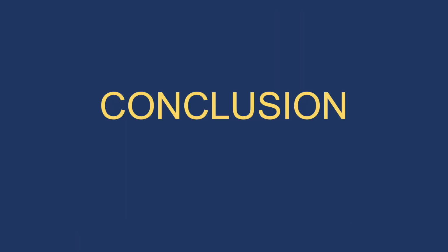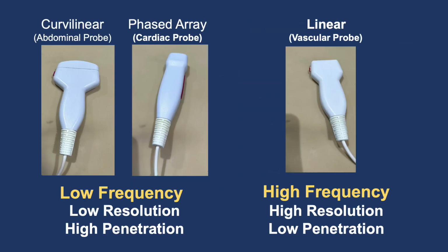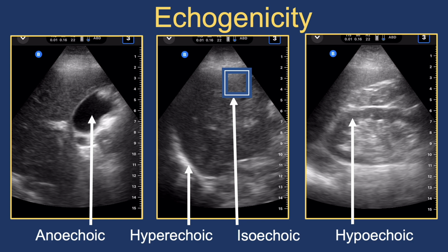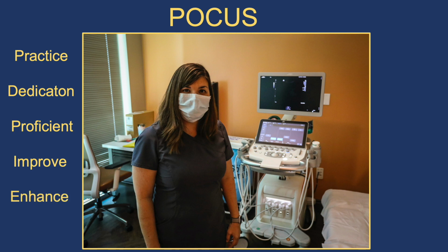In conclusion, understanding the physics, knobology, probe selection, probe orientation, and vocabulary of POCUS is essential for mastering the valuable tool in modern medicine. With practice and dedication, you can become proficient in using POCUS to improve patient outcomes and enhance your medical practice. So keep learning and keep practicing, and POCUS will make a difference for both you and your patients. I hope you enjoy POCUS as much as I do.